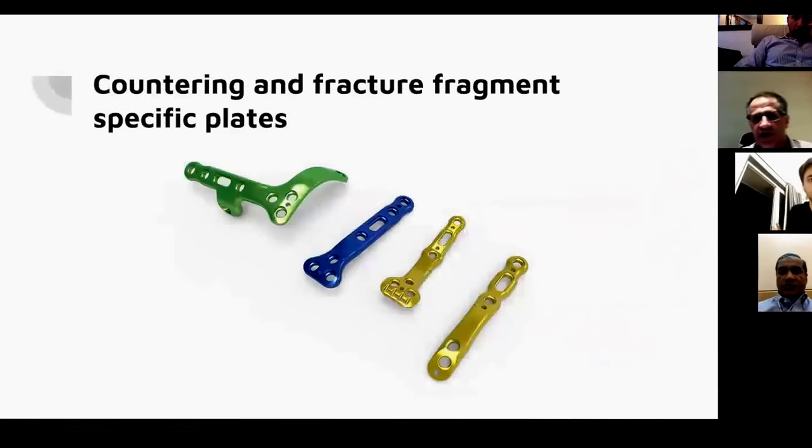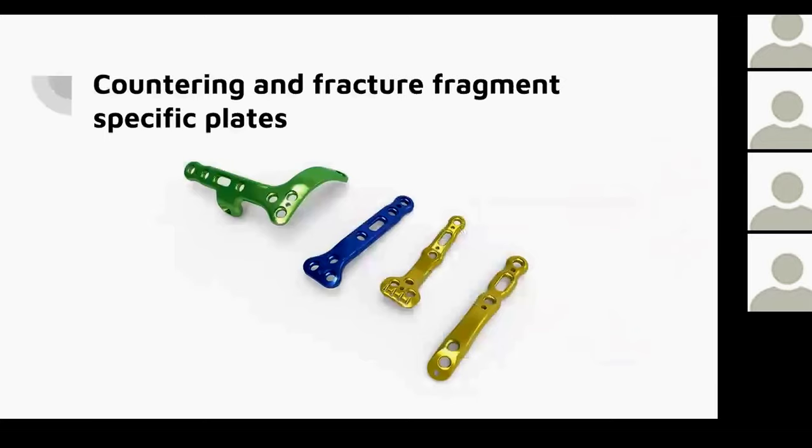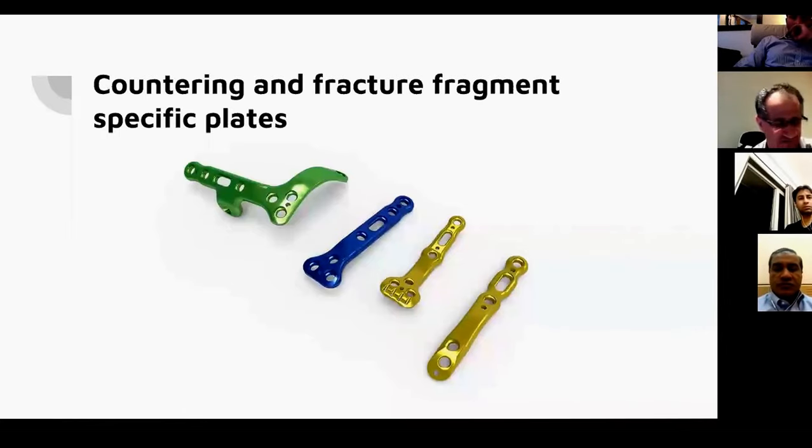And then you've got pre-contouring and contouring and fracture fragment specific plates. These are all available, and there are multiple options. And at this point, I would also talk about my distal metaphyseal fixation plates, such as a distal femoral plate with an elongated shaft to allow me to do more complex fractures. I'll talk about my individual different types of plates for my fracture fragment fixations.